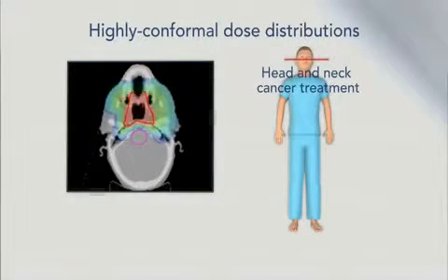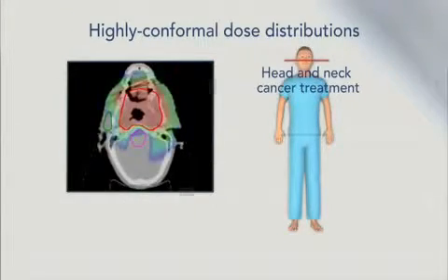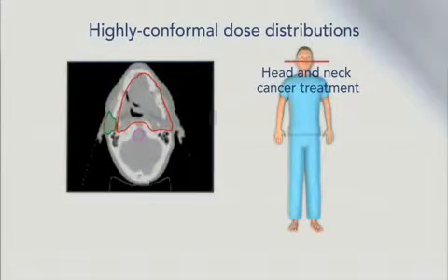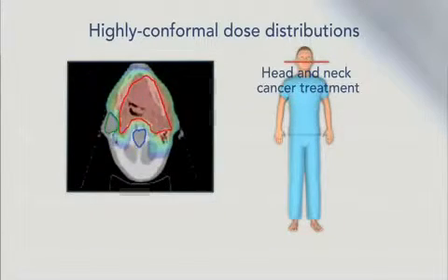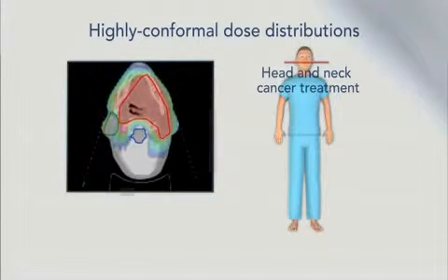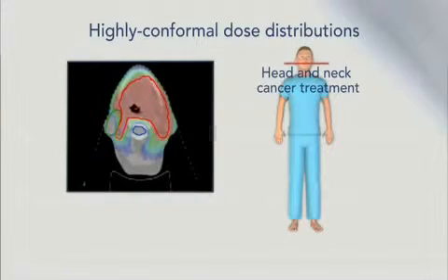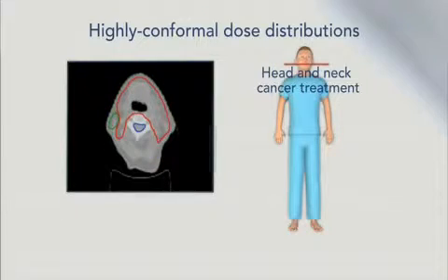Shown here are CT scans with overlaid structures and dose levels from a head and neck cancer treatment plan. The tumor, indicated by the red outline, is covered by the prescription dose, shown by the solid red color. The adjacent blue spinal cord and green parotid gland receive a very low dose. Our unique technique enables a sharp distinction between tumor dose and dose to nearby critical tissues. The parotid glands produce saliva, and maintaining their function after radiotherapy treatment has always been a difficult challenge.